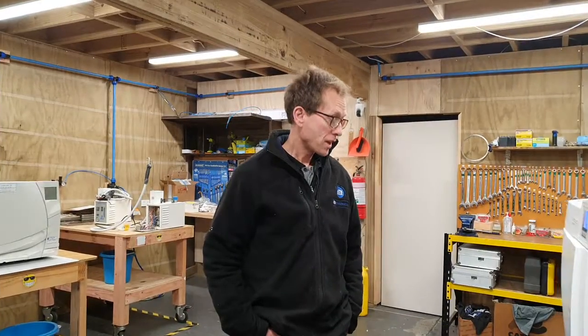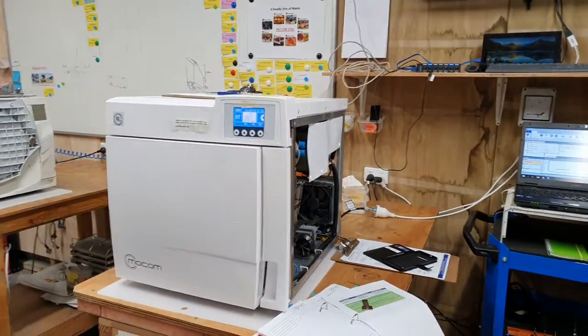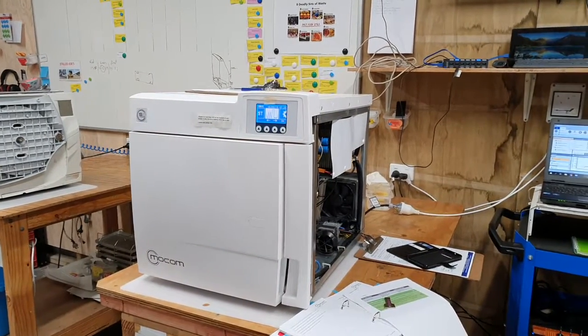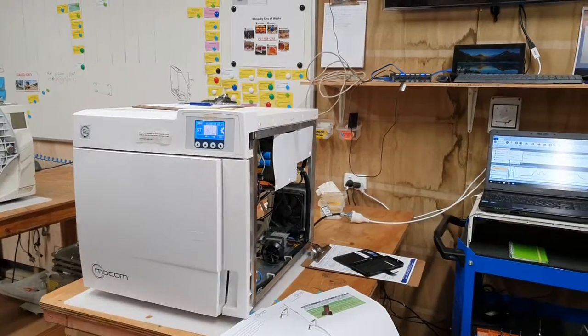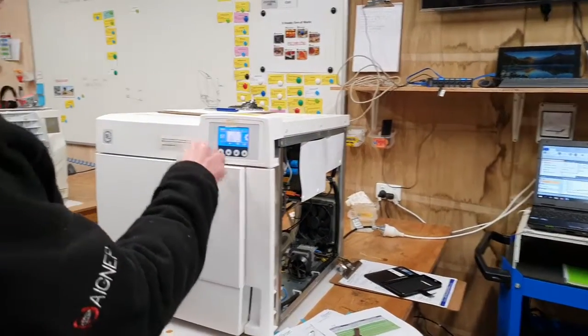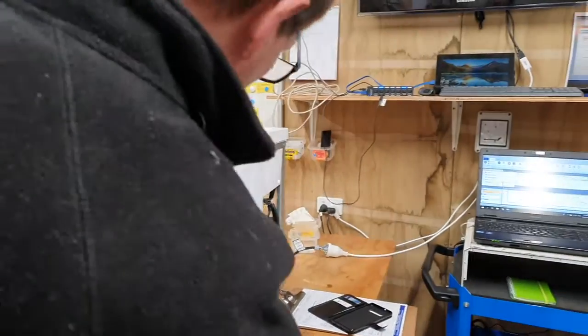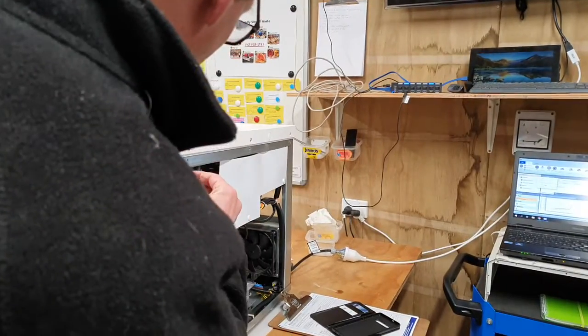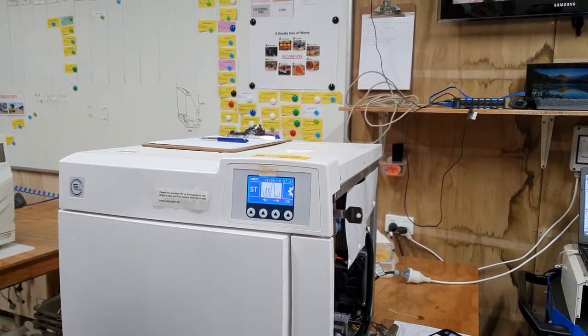Hello, we have a Mocom S17 Classic to download the last 50 cycles, which is what we want to do for a reasonable amount of diagnostics. We're at the home screen here, so should we put the USB stick in first? Put the USB stick in first, of course. And wait, you hear the beep to say it's acknowledged the USB stick?